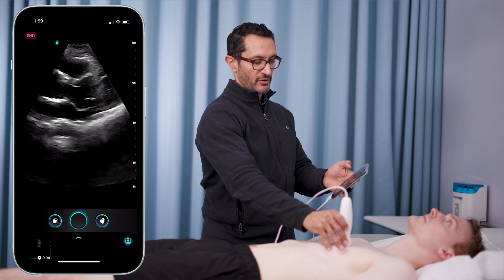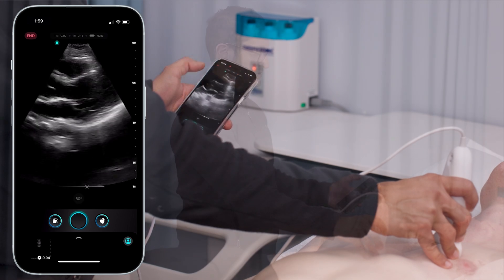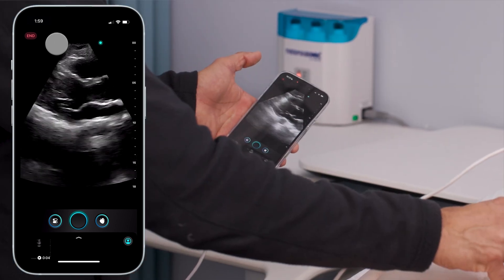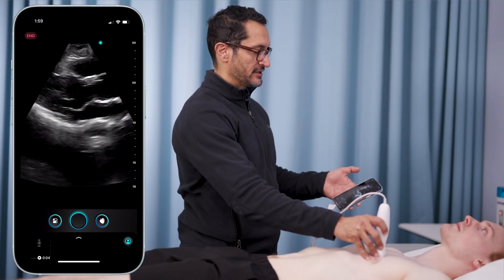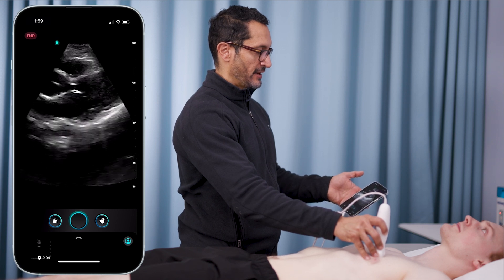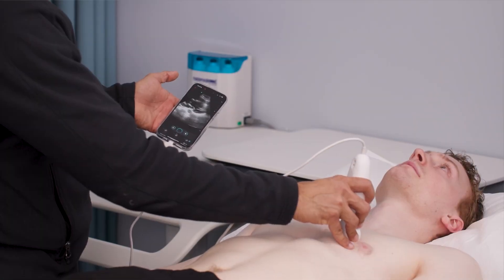I can see the descending thoracic aorta clearly. A common difficulty is people do it in different directions. Changing your indicator markers is always three buttons — one touch and you flip. The beauty of this is it's intuitive. I don't have to teach my med students or residents how to do this; they just hit the button and it flips back. User-based design built around the clinician.